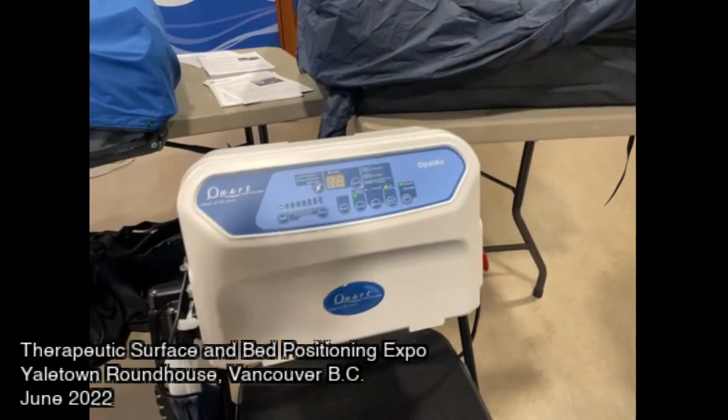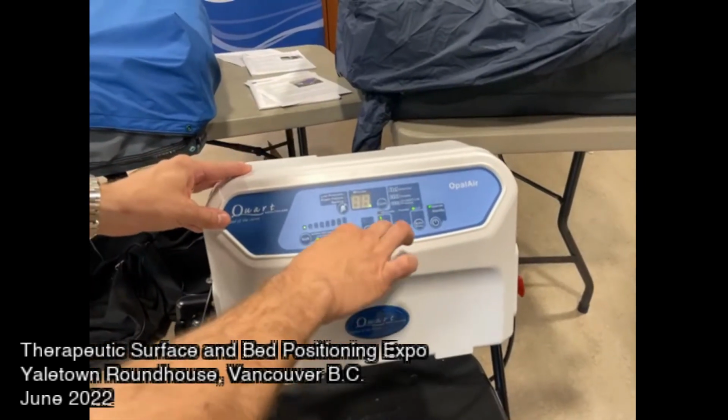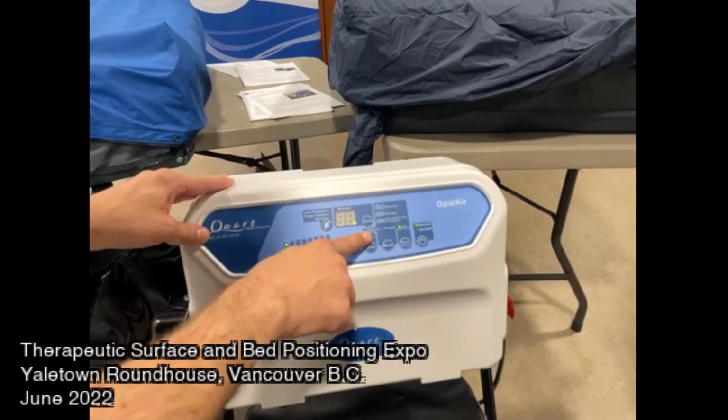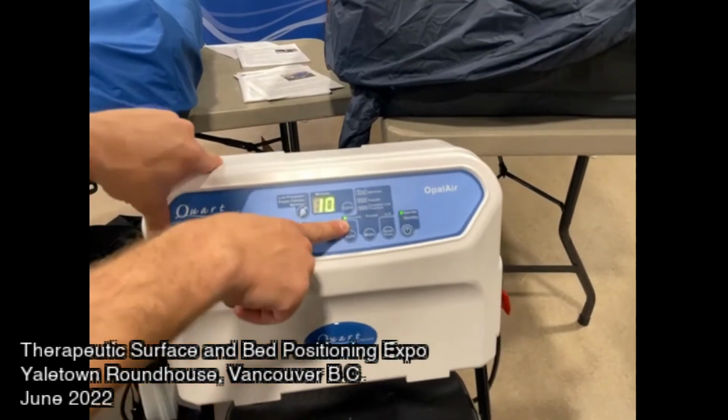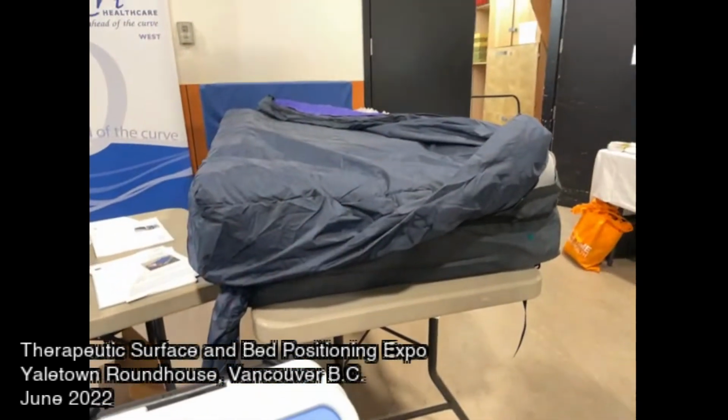So then you can imagine your resident is set. You can adjust it slightly. And then the only other thing you have to select is which mode you want. So there's 3 modes. Alternate is going to give you the best clinical benefit. That's when 1 in every 3rd cell is alternating.